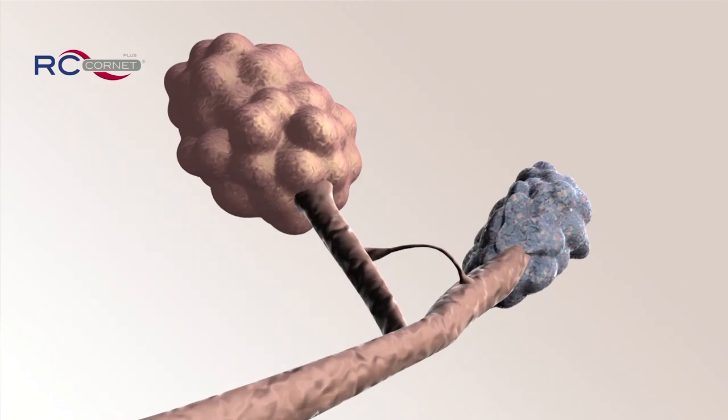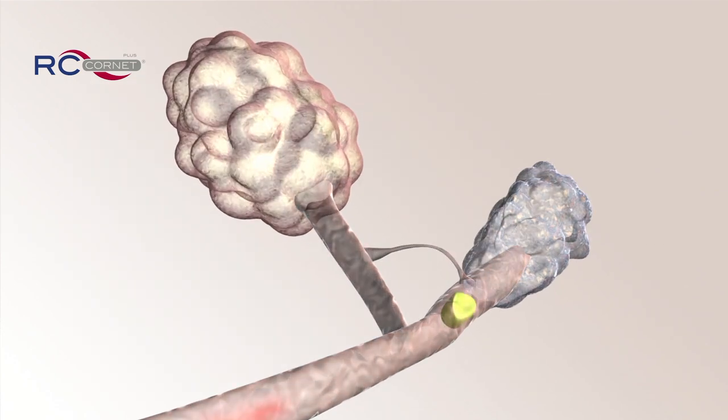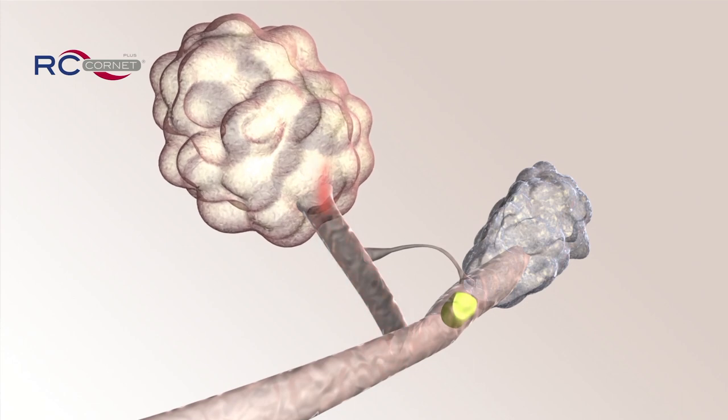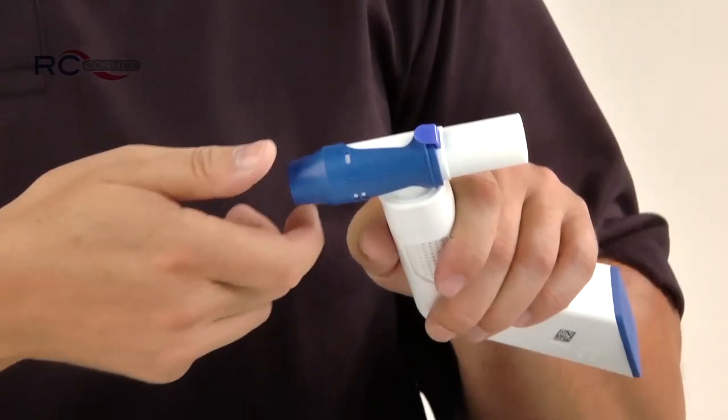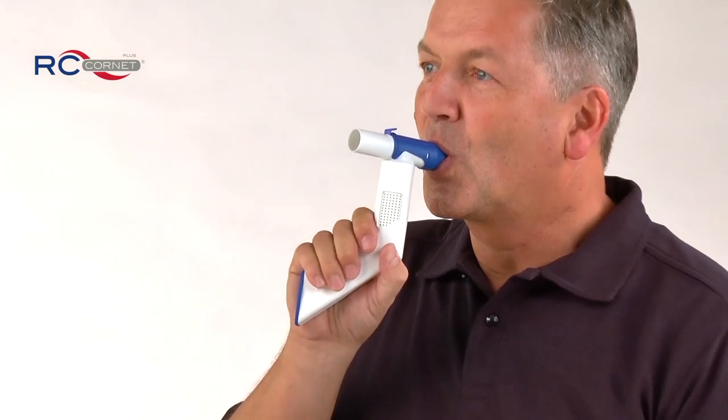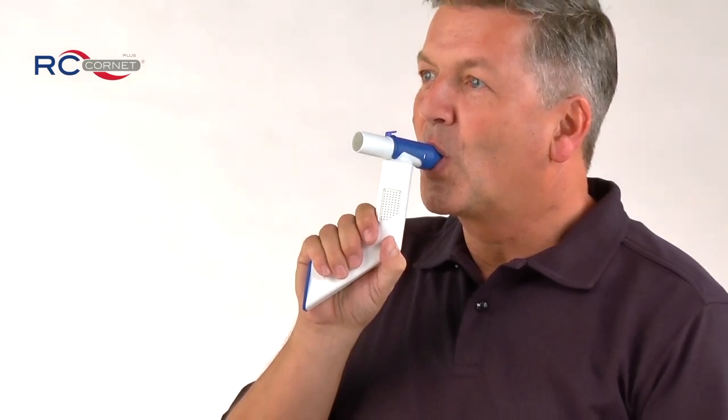Secretions can even cut off the supply of oxygen to some of the alveoli, causing breathlessness. Setting 1: Vibrating air pressure widens the airways and reduces breathlessness.